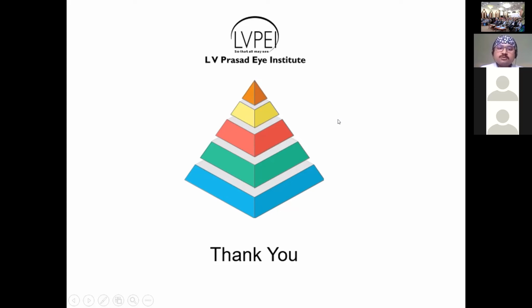It's correct that OCT is very effective in picking up the damage before, but it also equally depends on how effectively the OCT is done, what the signal quality of the scanning signal is, how effectively the technician has performed the test, whether the zones which have to be covered were proper or not, and whether there were no artifacts during the procedure. So all these things play a very important role.